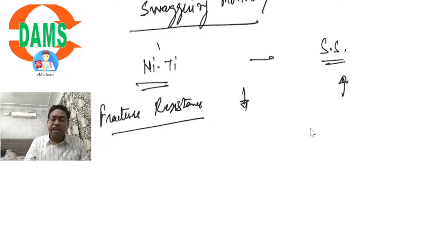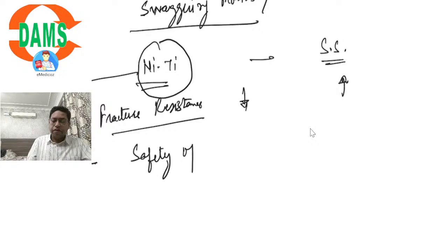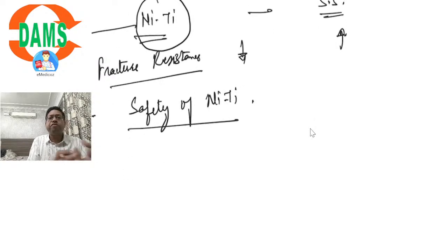And that's why nickel titanium instruments have a high tendency of separation inside the root canals if they are not used properly.